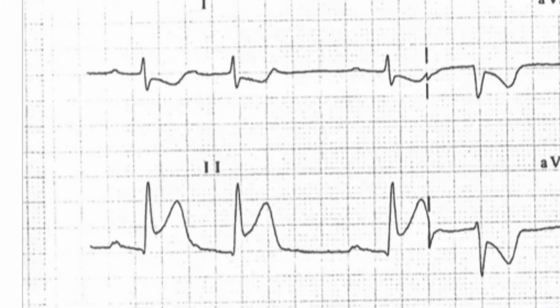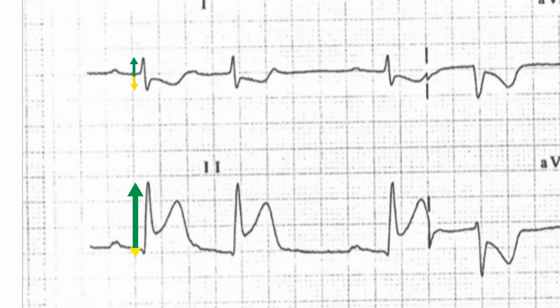The axis is normal, with an upright complex in lead 1 and an upright complex in lead 2. The upright complex in lead 1 is only borderline more up than down, and therefore the axis sits at the borderline of right axis deviation.